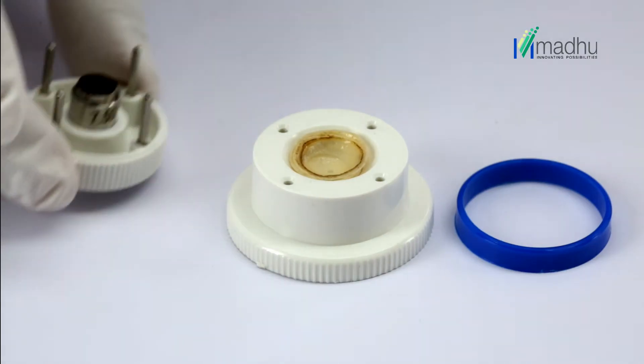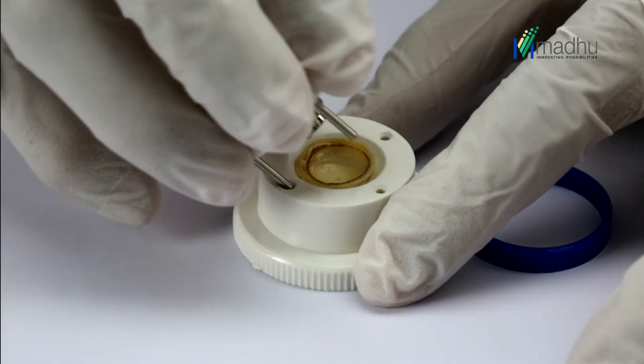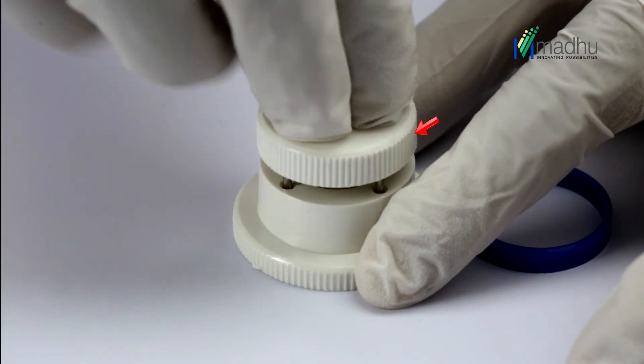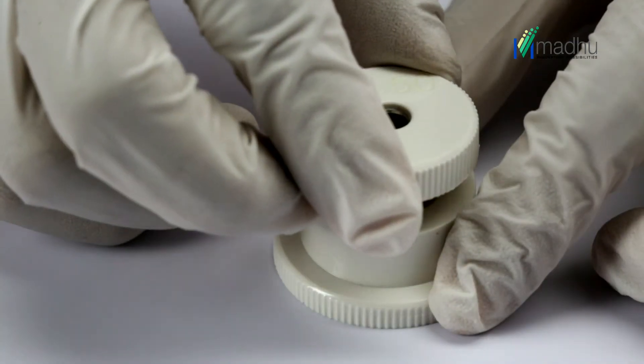Insert the four SS guide pins of the trephine blade housing into the corresponding holes in each corner of the cutting block base. Place fingers or thumb directly over the trephine blade housing and press down firmly while holding the cutting block base.